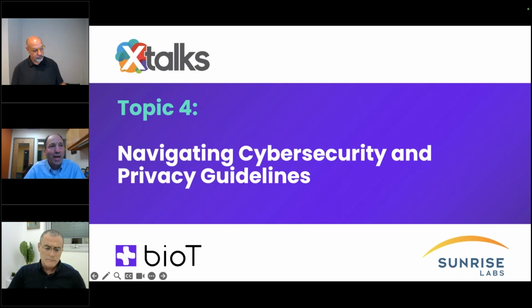Now, if you decide to open up your safety and efficacy part of it onto the cloud, then you're including that whole chain into it. So the simpler thing to do is to separate them. If the benefits are doable, then you'll open it up, knowing that now you have to make that whole cloud infrastructure part of your medical device. The good news is that that's becoming more developed, more common, and people are trying to do that now.